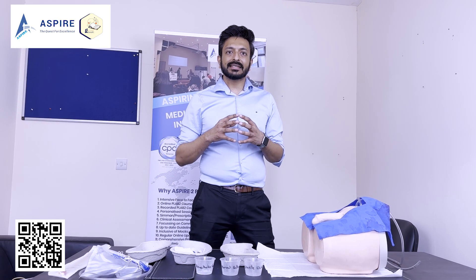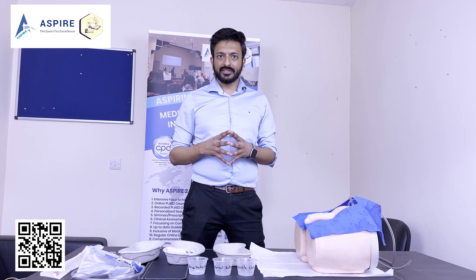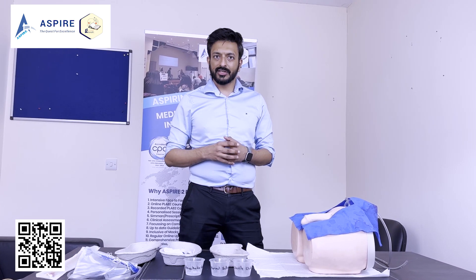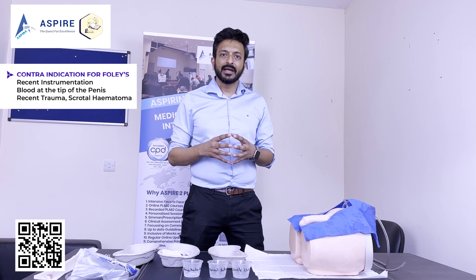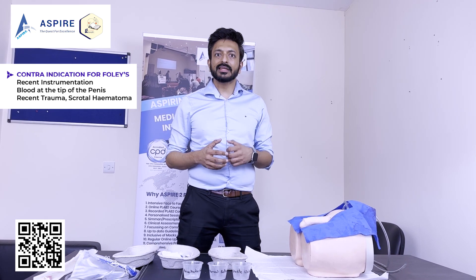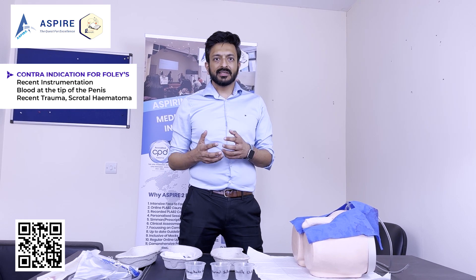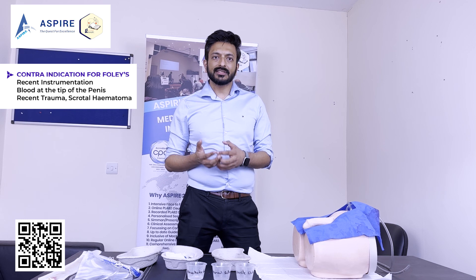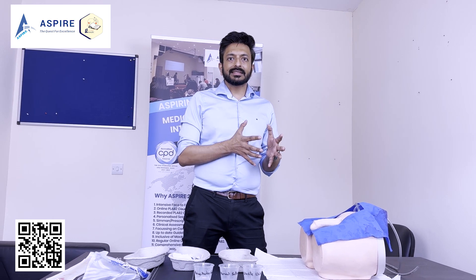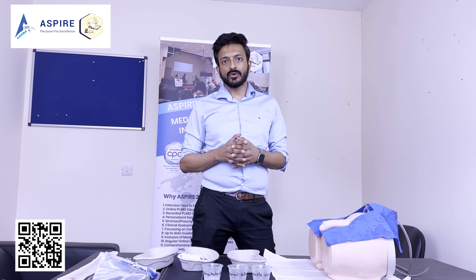We will discuss catheterization. When doing a male Foley catheterization, you have to rule out some contraindications. Make sure you ask the patient if there was any recent trauma, if there is any scrotal hematoma, any bleeding from the external urethral meatus, or if the patient has had any instrumentation recently. If these are present, try not to go for Foley catheterization — you may have to go for suprapubic catheterization.